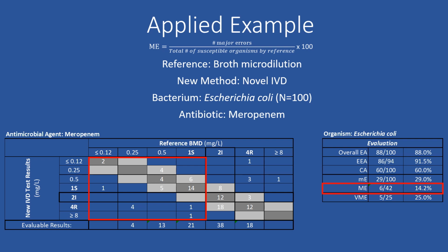I encourage people to explore doing repeat measurements of isolates to control some of these variables. If that still doesn't resolve the issue, it deserves a conversation to explore a different approach to implementing a test method. Now, the last thing I will mention is non-fermenting gram-negative bacteria are notorious for throwing off AST statistics. You may be able to get away with stratifying these results to perhaps remove these isolates from a panel if they continue to be problematic, or increase the number of repeat measurements you do and report modal MICs.